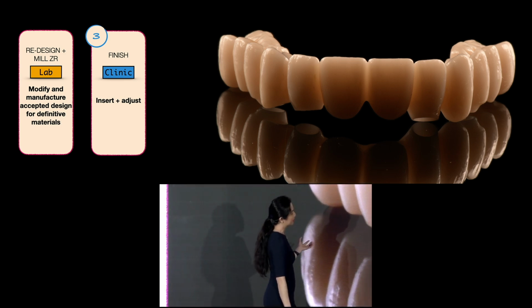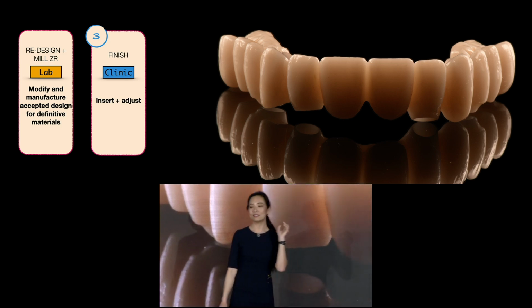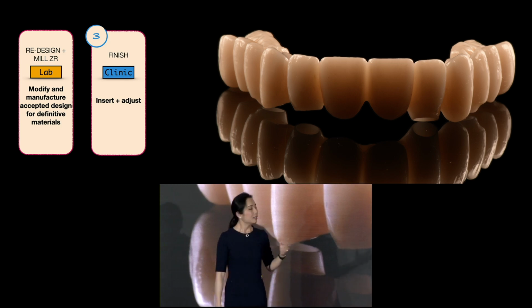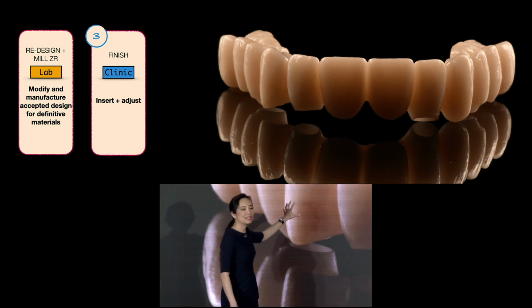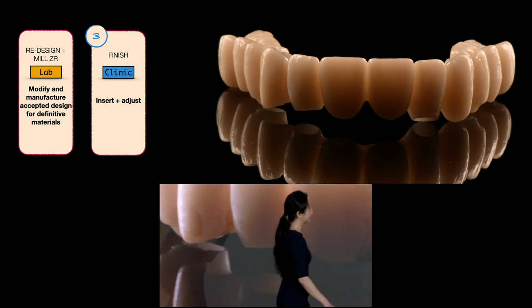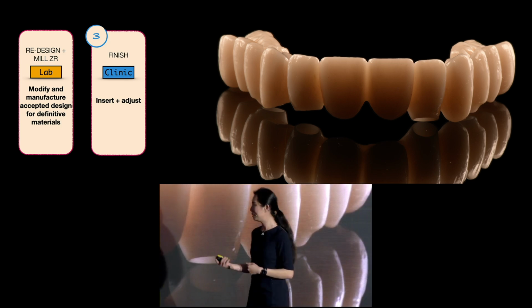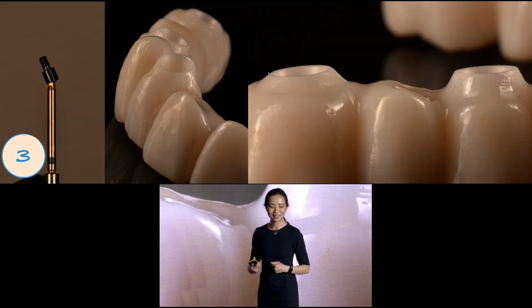So what you're seeing here is actually the zirconia framework from Procera. This is the old one, too. So what you're finding is that even with the old framework, it is possible to get great outcomes, because I've heard enough complaints about that. It comes out great as long as the lab knows how to work with it. But with a new framework, it looks even better.